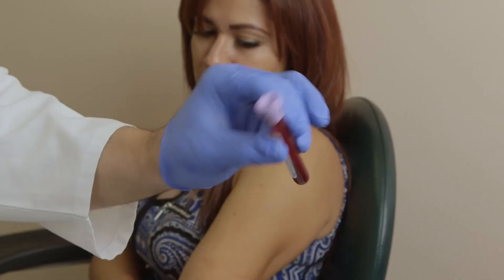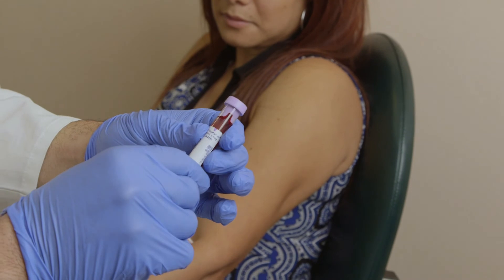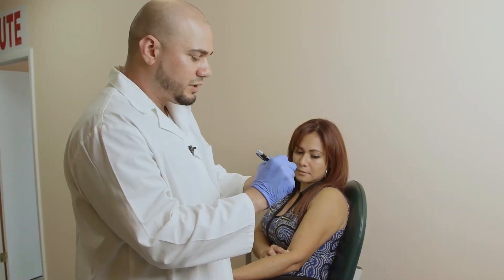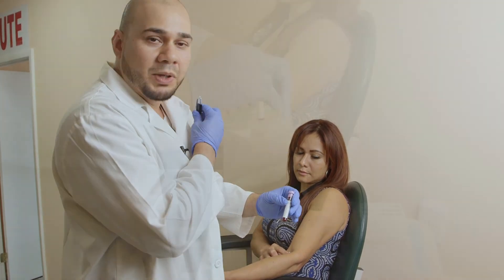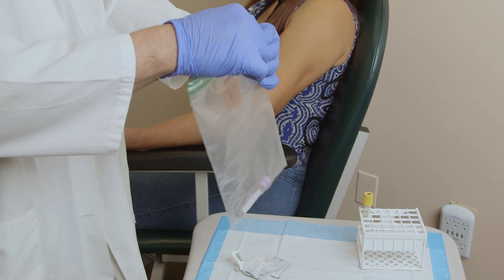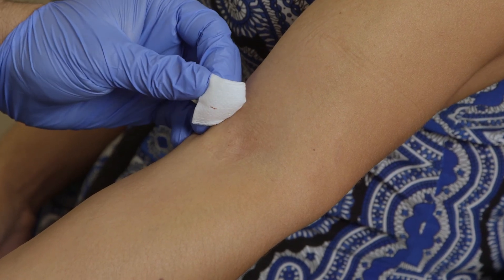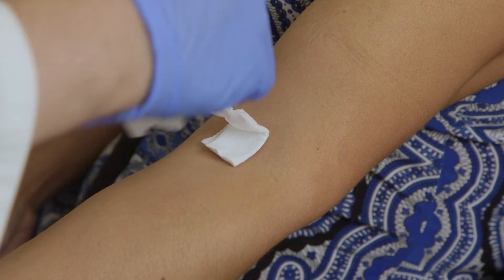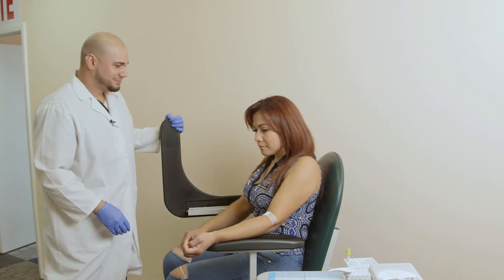This is where I will put the patient's name, date of birth, phlebotomist credentials, and the time or other information about this test. I will place the specimen in the transport bag and close it to be sent off to the lab. Next I will check for hemostasis to see if the bleeding has stopped — and it has — so we will proceed with putting tape over it. Thank you, and we will call you as soon as we have the results ready for you. That's it — thanks for joining me at Brantford Institute.